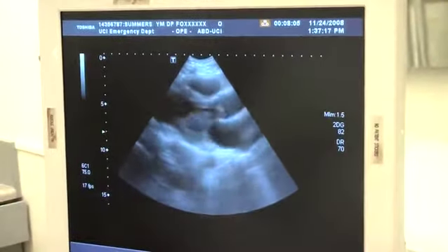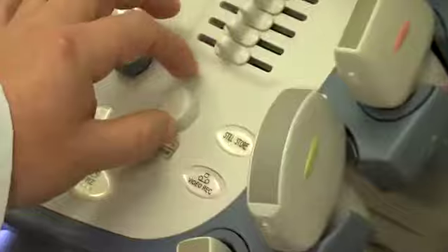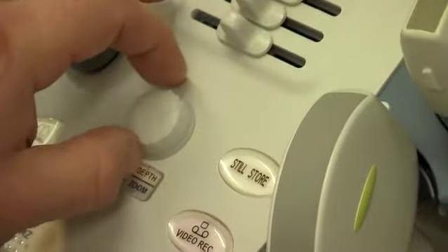So I'm going to decrease my depth a little bit to make the heart fill up the screen. And look, see how the heart fills up the entire screen. I get a good resolution on all the structures of interest.